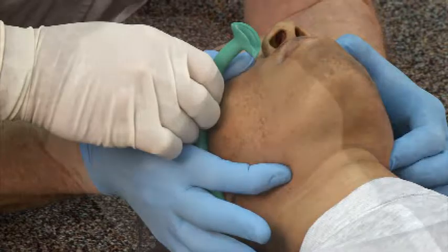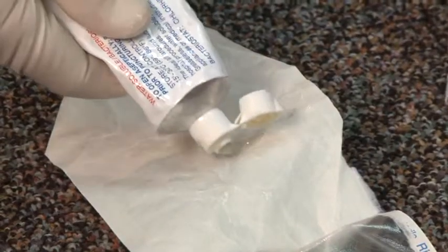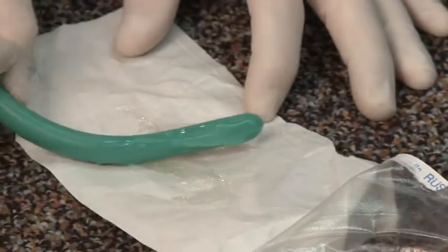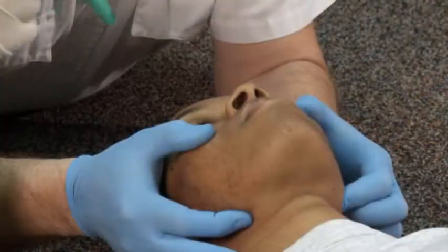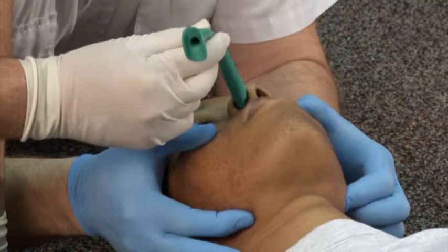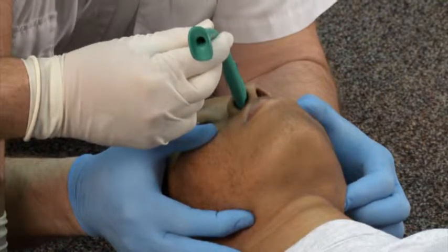The distal tip or non-flanged end of the NPA is lubricated liberally with a water-soluble jelly and slowly inserted into the nostril of choice. Insertion should be in an anterior to posterior direction, along the floor of the nasal cavity, not in a superior to inferior direction.